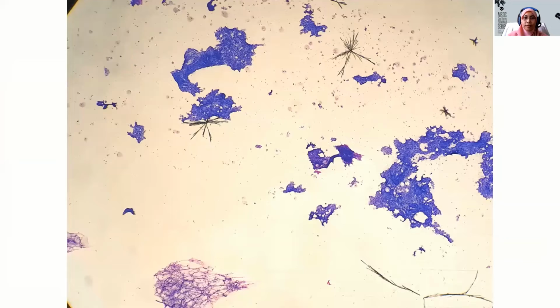So this is the low power view of the smears from the breast lump. If you can see here, this is adipose tissue, and these are all ductal cells. It looks benign, looks organized. Some areas show papillary-like structures, but not too prominent. And these stars are actually crystal artifacts, mounting artifacts.